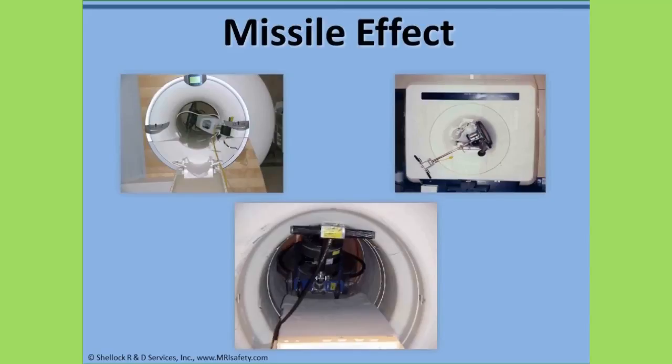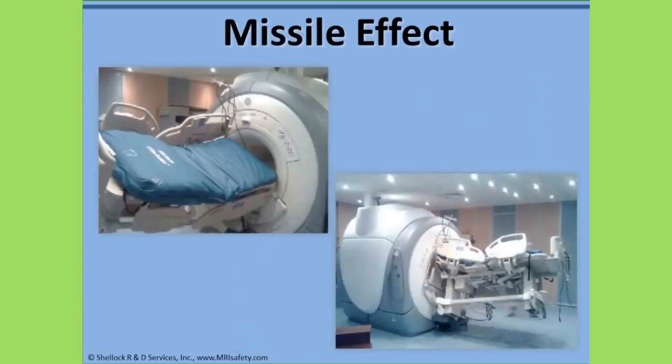Because a relatively large ferromagnetic object may be attracted and then attached to the MR scanner by great force, it is frequently necessary to quench the magnet in order to remove the object if the MR system is using a superconducting magnet. In this accident, an extremely large hospital bed became a projectile and is now firmly attached to the powerful magnet of the MR system. Note the immense force that is evident as this huge bed was lifted up off of the floor.